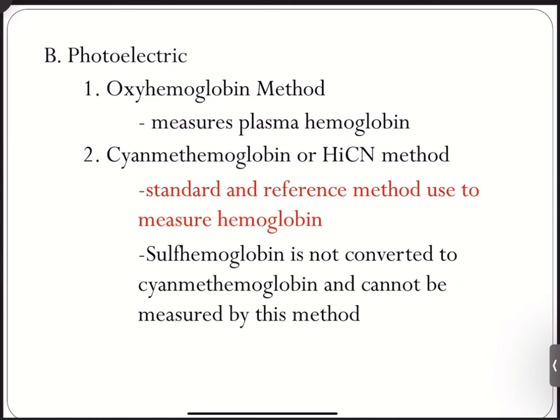Then you have the standard and reference method being used in measuring hemoglobin. How do we do this? You use a reagent like your Drabkin's reagent.